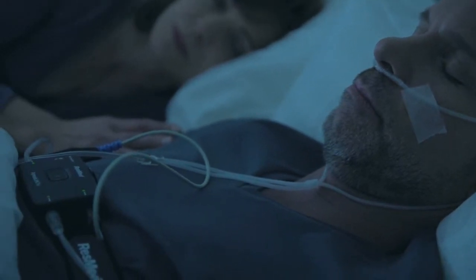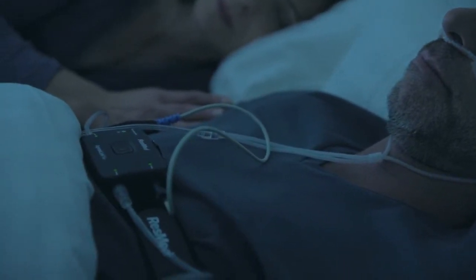The ApneaLink Air will monitor your sleep during the night, documenting your breathing patterns and possible respiratory events.